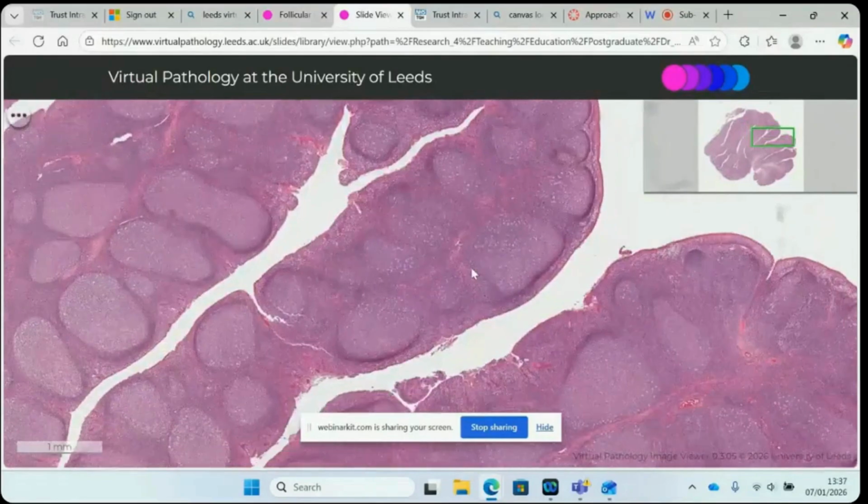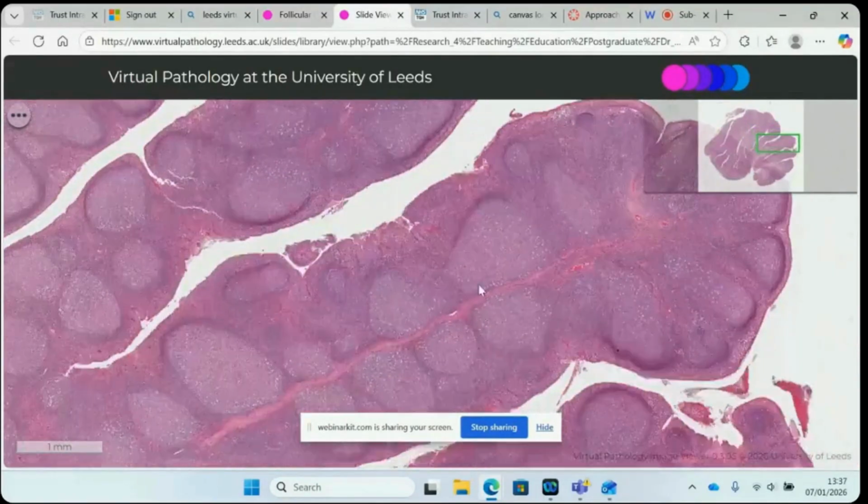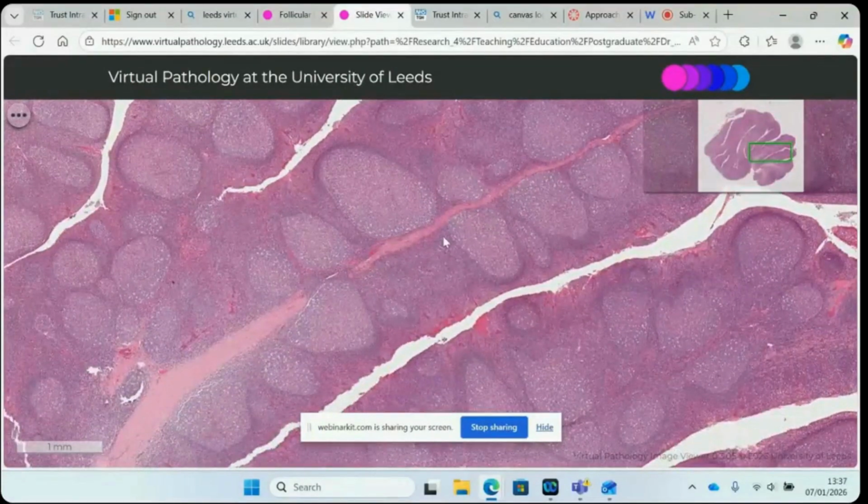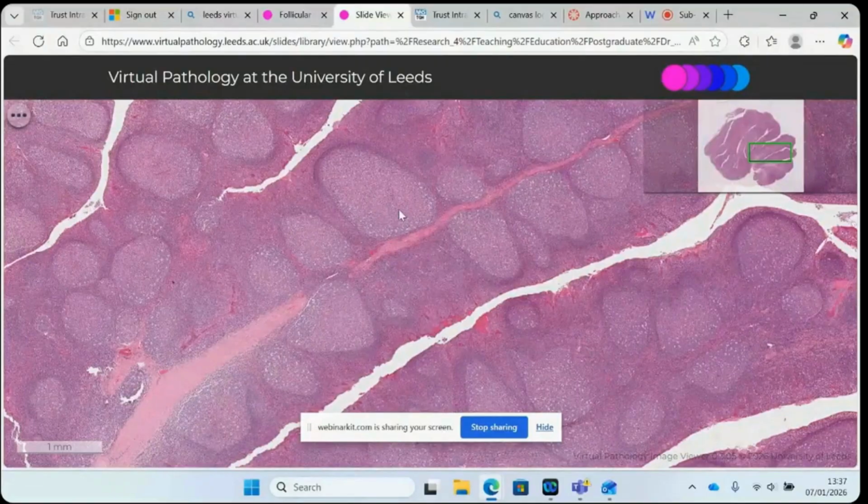But in some cases, the follicles aren't that many, or in a tonsil where you've got tons of them, it can be harder to see. But look at those key features: polarity across the germinal center, polarization of the mantle zone, and also, most importantly, tingible body macrophages.